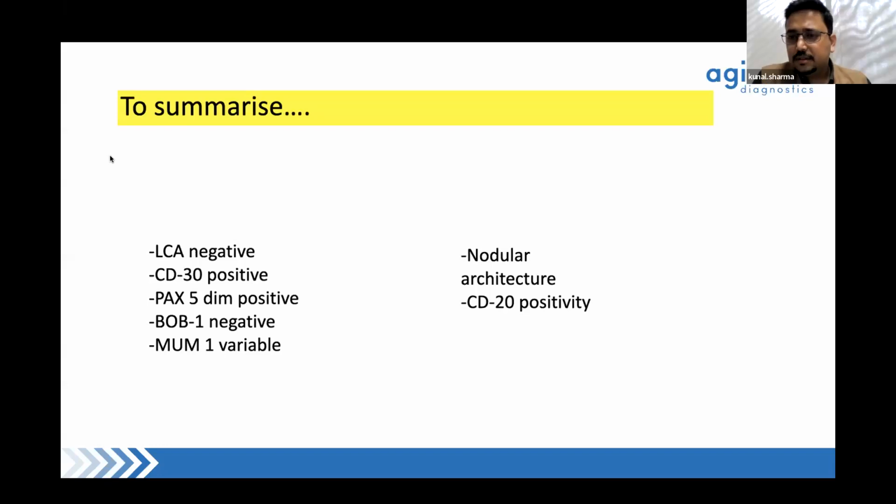Yes, Dr. Lakshmi. Sir, actually, I was the one who asked the question regarding GATA3 positivity. In Tata, we used to do GATA3 as part of the classic panel. My consultant used to do it on all Hodgkin's lymphomas, and we had seen nuclear positivity. So that would be a nice marker too.